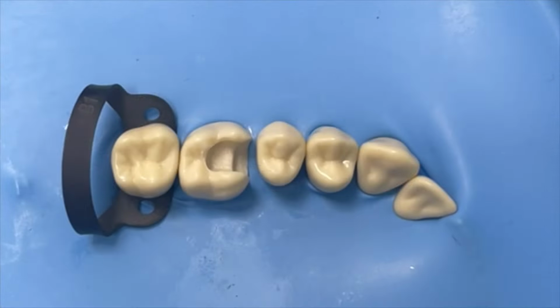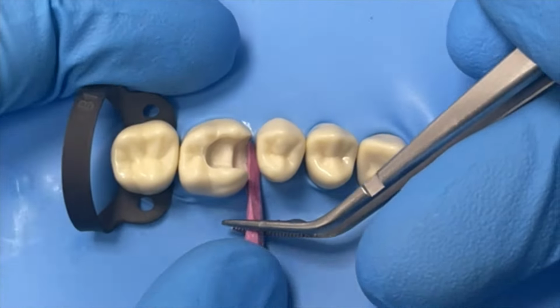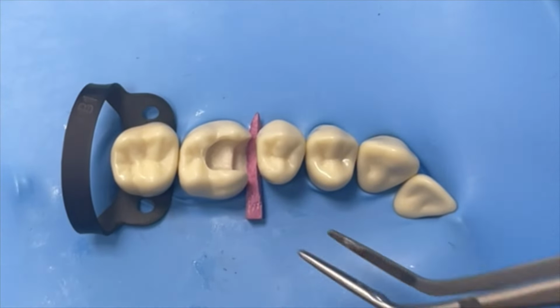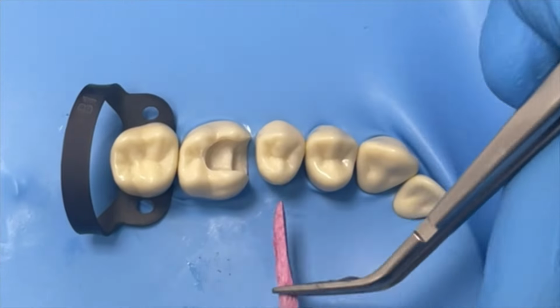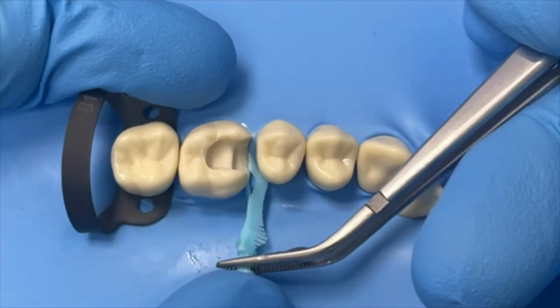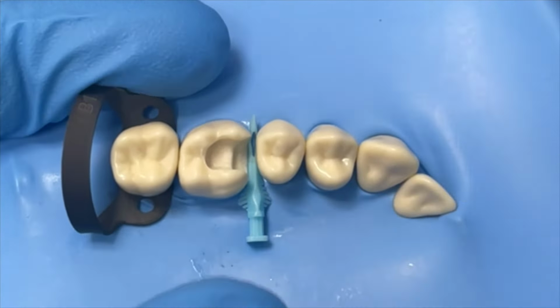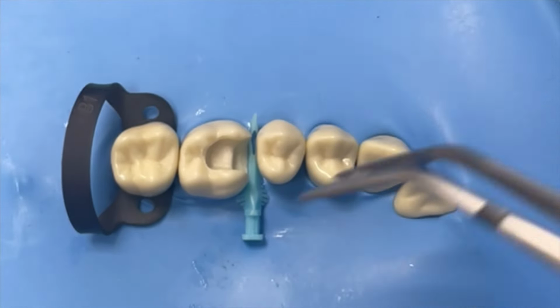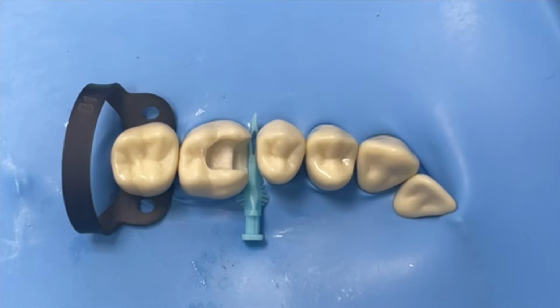Okay, so let's have a little look at the Elliot ring in action. I've got an MO cavity here, and I'm going to start by choosing my wedge. With these typodont teeth, sometimes it's quite difficult to get a wooden wedge to sit below the margin horizontally. It's a bit easier in real life in the mouth, but on these it's tricky. So I'm going to pick one of these low profile diamond wedges. That sits lovely. Now these are great, but one of the problems with them is they don't, in my opinion, give quite as much separation as the wooden wedges.